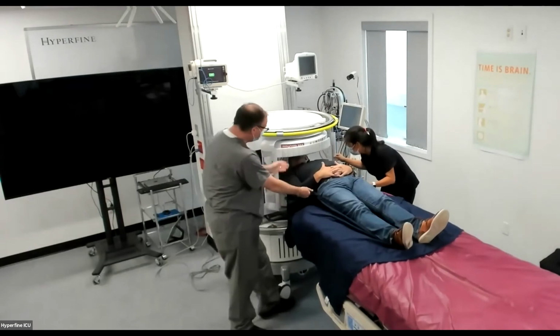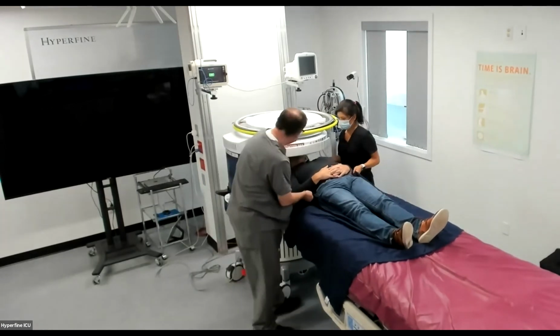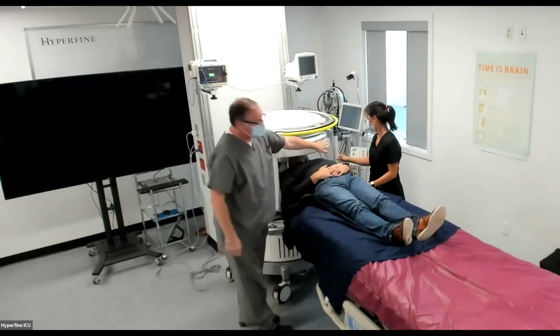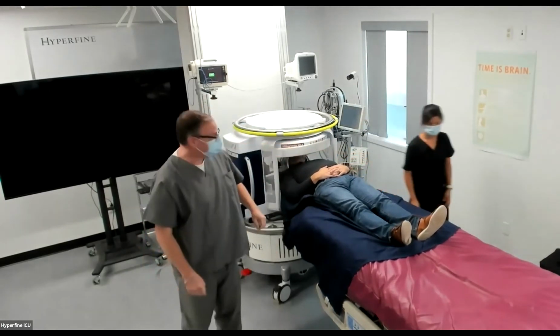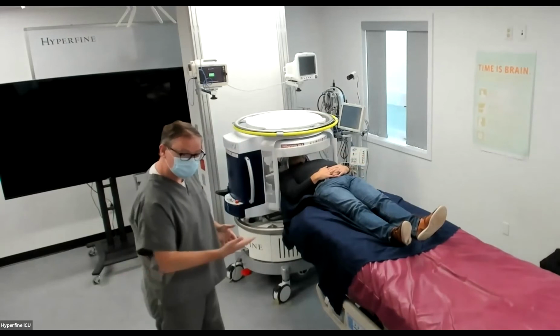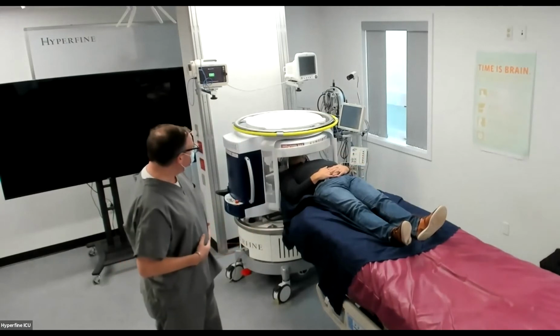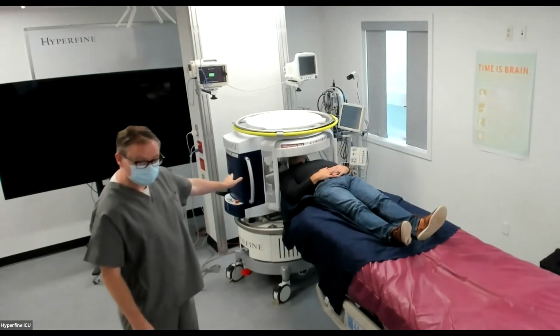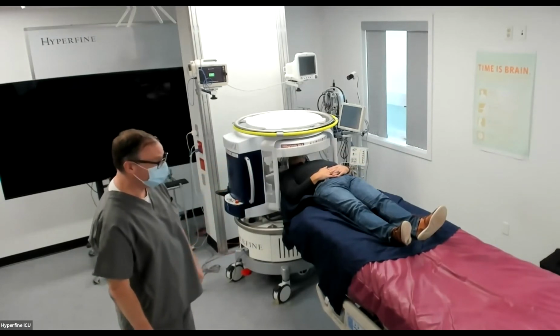And you can get a good visual look. If you're not all the way in, you can shift them in just a little more. On Sam's side, the little bit of RF screening we do have opens up so she can access the patient's head and help guide them in. You might be able to hear a few clicks and pops. That's the auto test phases of the scanner running.